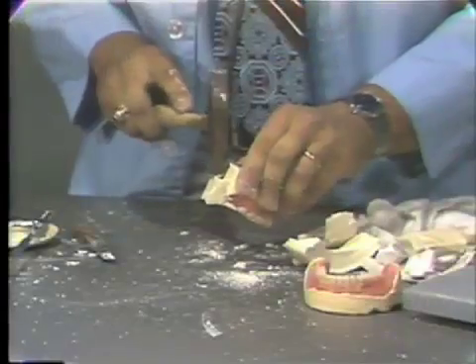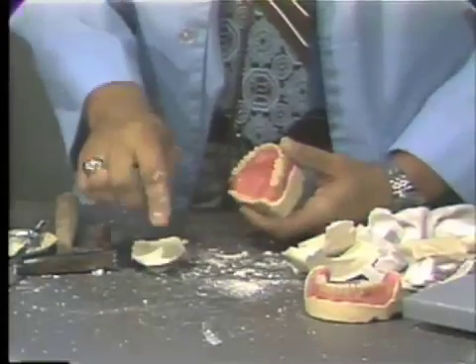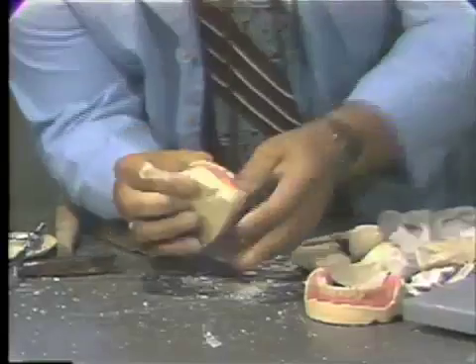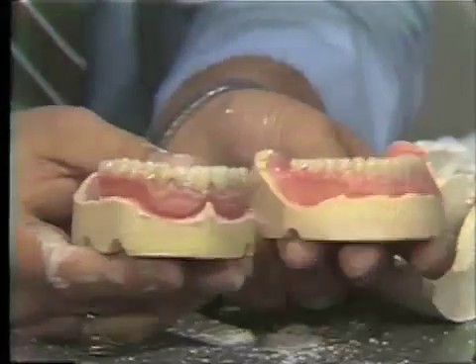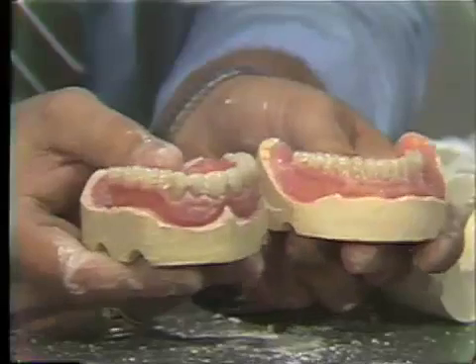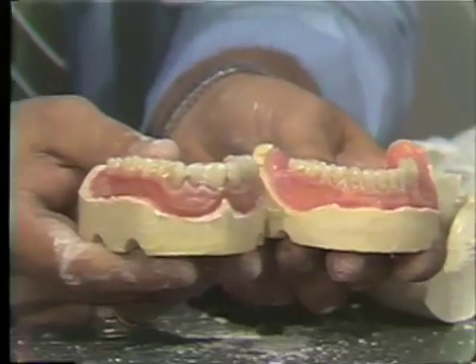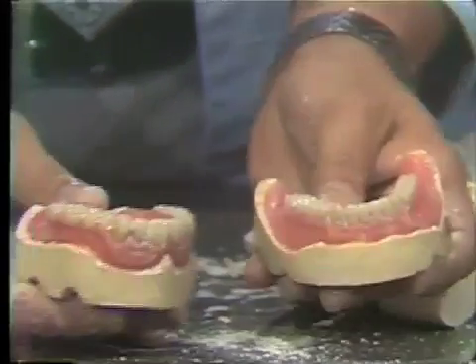The palatal portion will come out very easily if you just tap, and generally it will come out in one segment. If it does not come out readily, then you may want to make a groove in the palate and use a laboratory knife to fracture it away. You notice the dentures are now attached to our master cast. For our purposes in this course, we are going to leave them attached to the cast for a short time because we are going to remount our dentures doing a post-processing remount. To remove the denture from the master cast, we take them to a model trimmer and trim the excess material from the tissue side of the denture, then use a shell blaster to remove the rest of the stone from inside the denture.